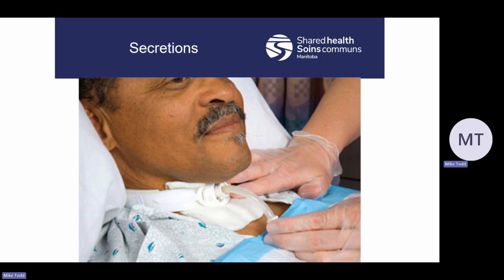Okay. When you remove these tubes from their trach, if they have a speech valve, you unscrew that from the end of the inner cannula first, and then take the tube out. To take the inner cannula out of the patient's trach, you just carefully twist it. It should unclick and then slide right out. It's not a huge procedure. Again, patients should be able to assist you with this.